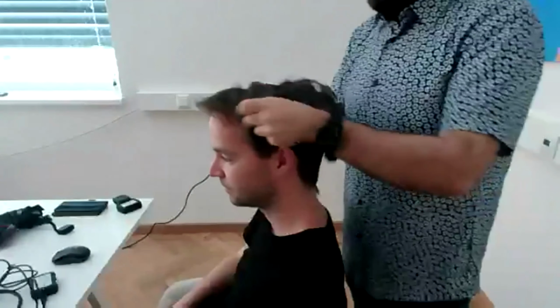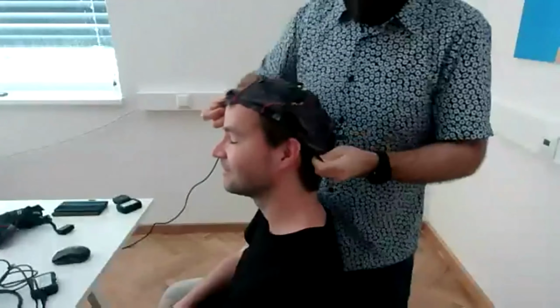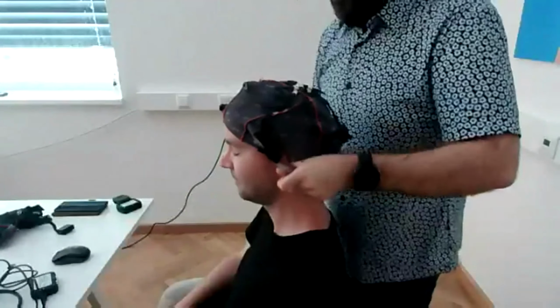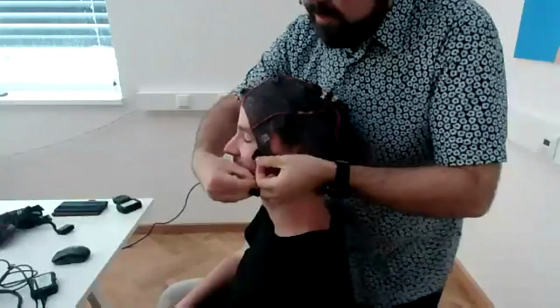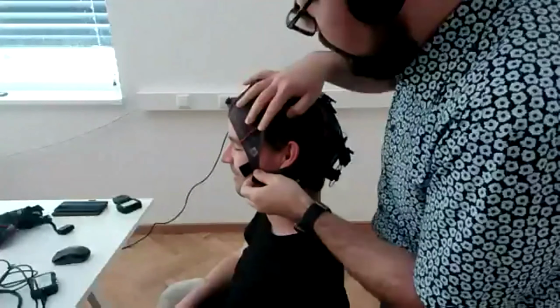And now we will jump to the preparation of the dry electrodes pretty quick because time is running. So you saw the difference of the preparation of the other one. So we will have a cap connected to the amplifier.